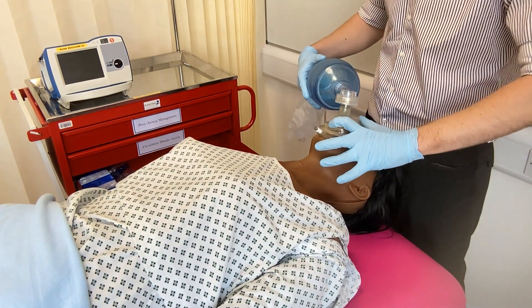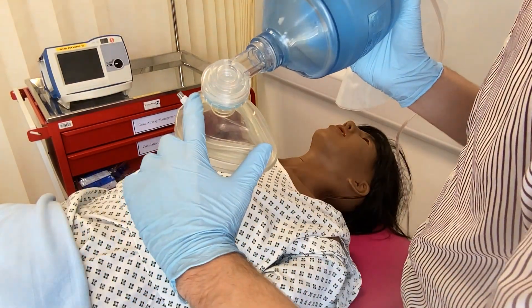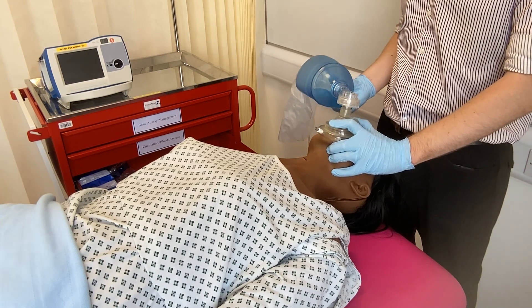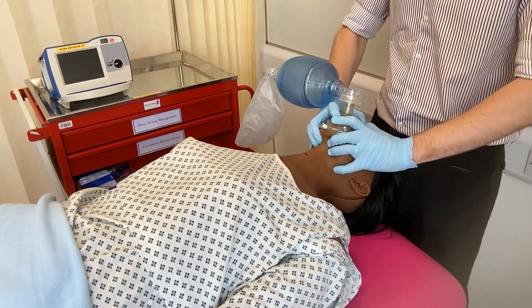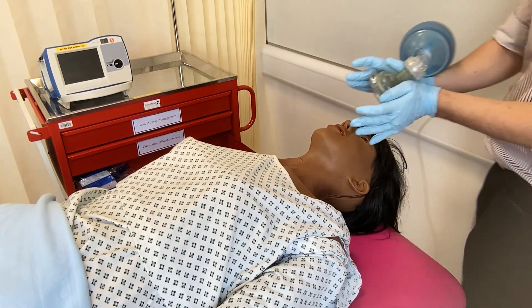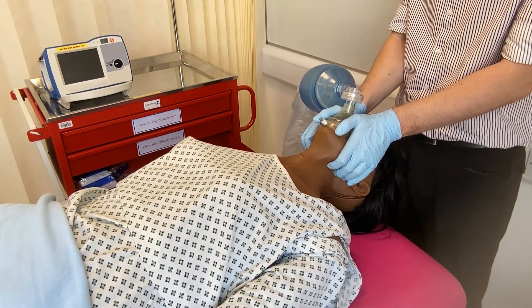If there is only one airway practitioner, a C and E grip with one hand is used while the other hand compresses the bag. Make sure to pull the patient's face up into the mask — do not force the mask down onto the patient's face. The C is created by the thumb and index finger holding the mask, and the remaining three fingers form an E shape to complete the chin lift. You do not need to fully compress the self-inflating bag, as over-compression will cause high intrathoracic pressure and can cause a pneumothorax. For the two-person technique, the first person uses a C and E grip with both hands, or alternatively a jaw thrust where the base of the thumbs are placed on the mask and the remaining fingers grip the jaw. The second person then compresses the self-inflating bag.